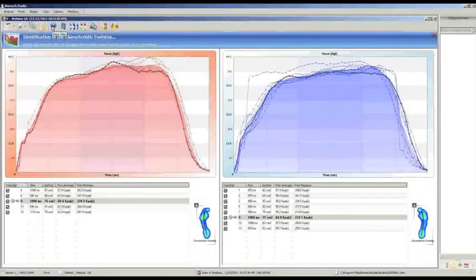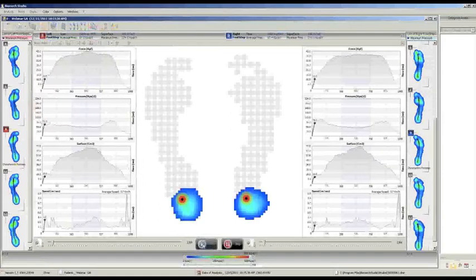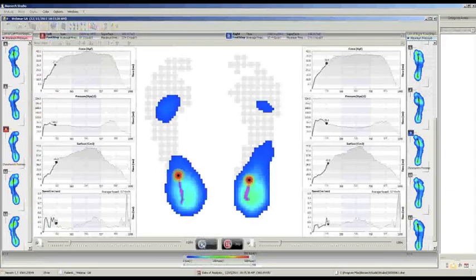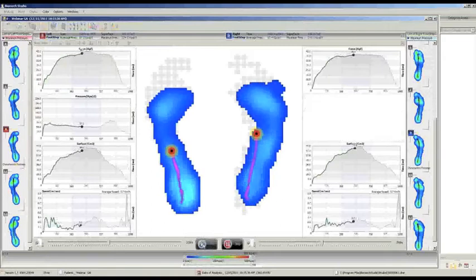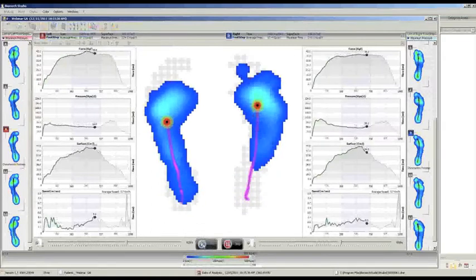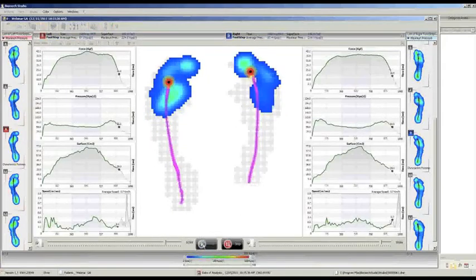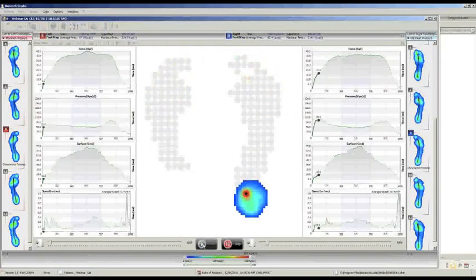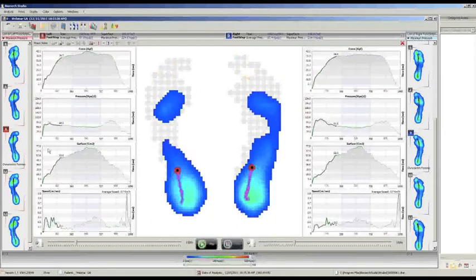If we switch to another section, we are going to see in real time — if I click on play — the movie of the distribution of pressures. At the same time, we see the curves of force, pressure, surface, and speed going ahead like the image. Also, in this case, we can switch over the different footprints.